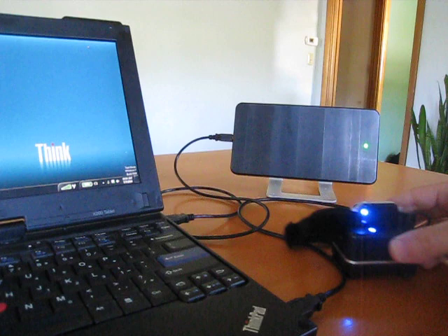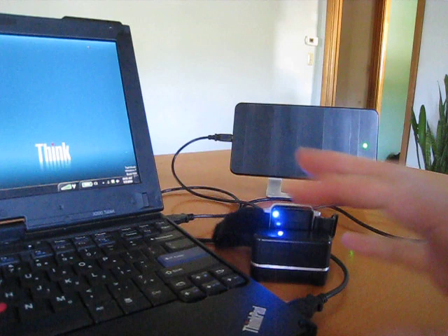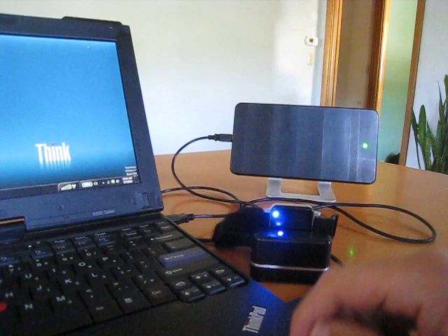In the back here I also have a wireless access point which is used for the Opal to transmit data directly to the laptop wirelessly when it's being used in streaming mode. The access point is connected to the computer also by USB cable.